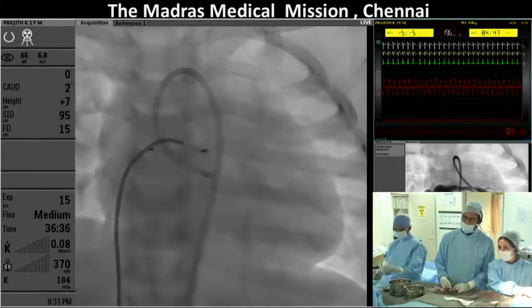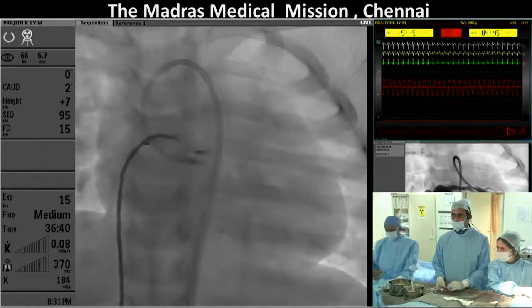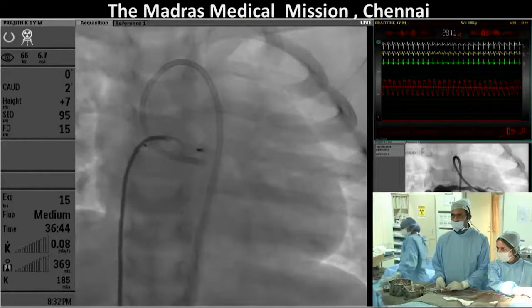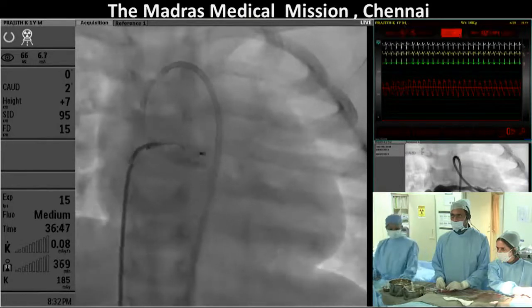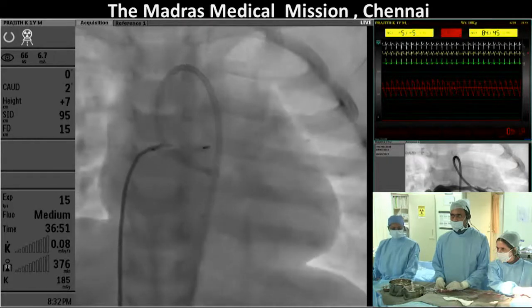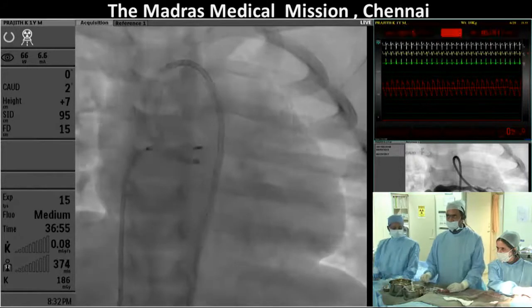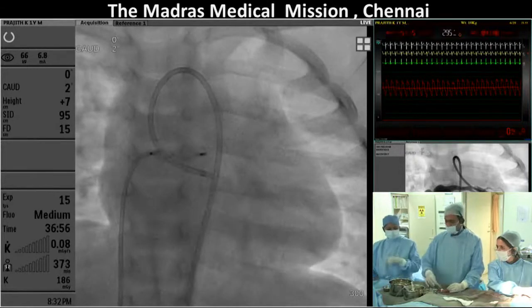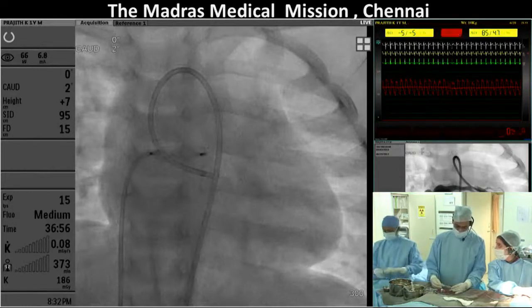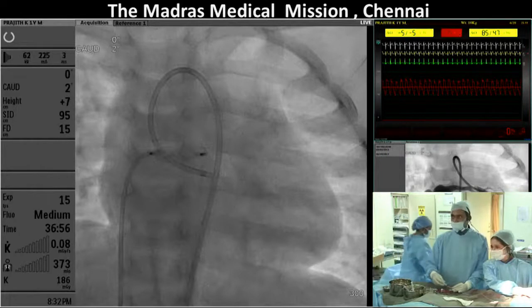So you fill the coronary with contrast, there's no oxygen in it, and you almost invariably get ST segment changes. And I didn't know this before he closed the fistula, but now that he's closed it and he filled it with contrast, the heart rate didn't fall. Since the heart rate didn't fall, he's probably okay as far as, now he may get ischemia somewhere else, but the absence of a slowing heart rate, I think, me personally, I think that's very reassuring.